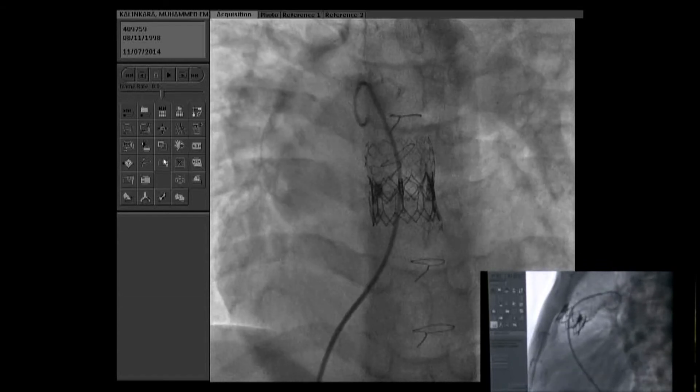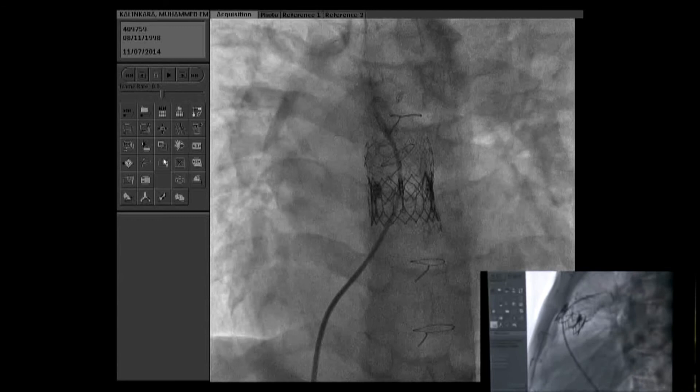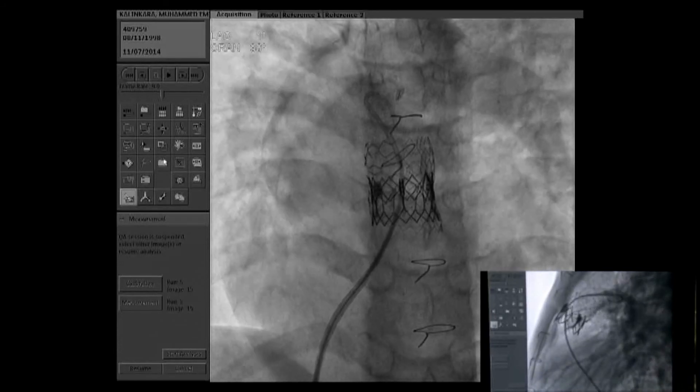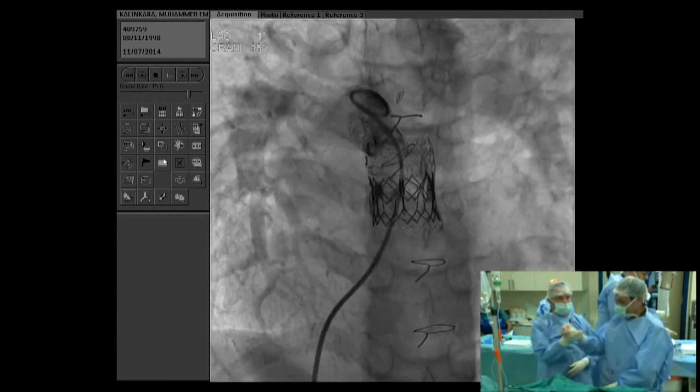You see? In the right VA — go back a bit. Maybe we go to the left VA. Now it's perfect. So you're going to do the final injection, yes? Can you see the angle? Biplane? Go. You see? Very good. Ahmed, you're always right. Very good. Well done. This is a wonderful case. It's excellent. So we'll wait for you here and then we'll go.